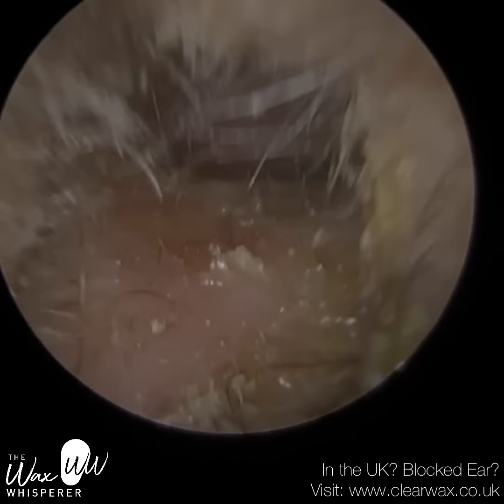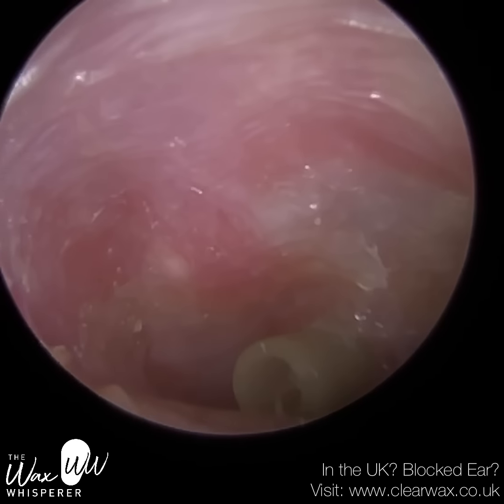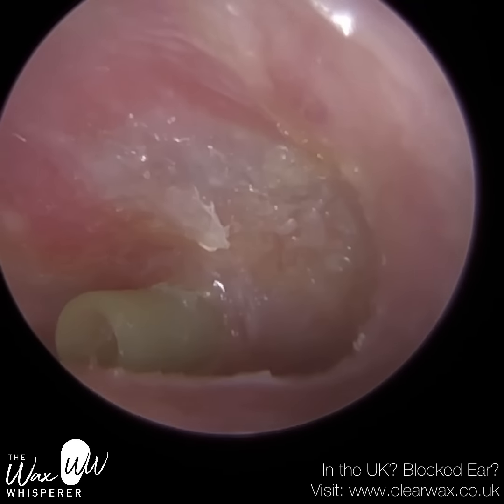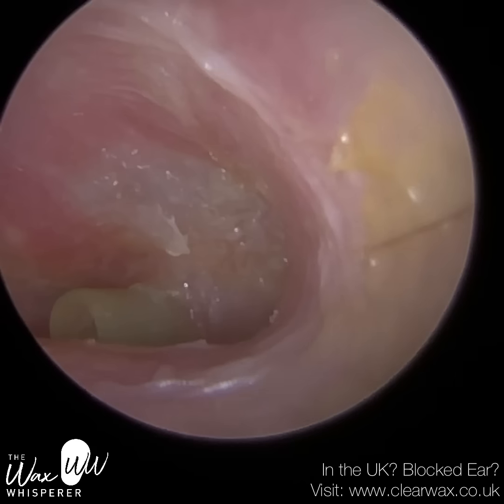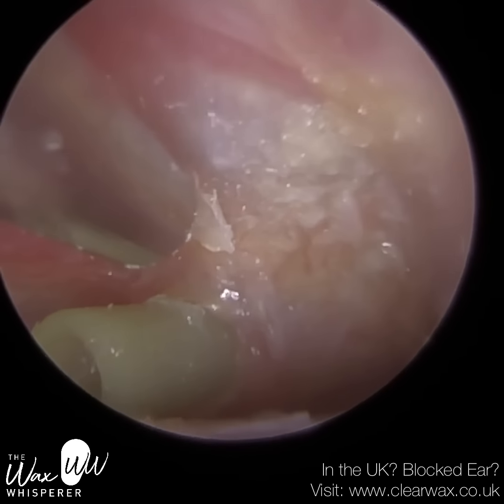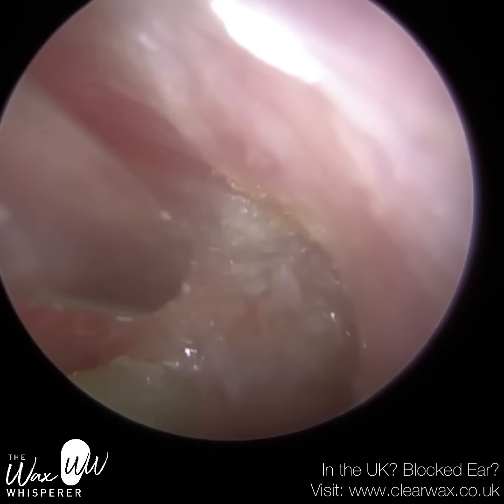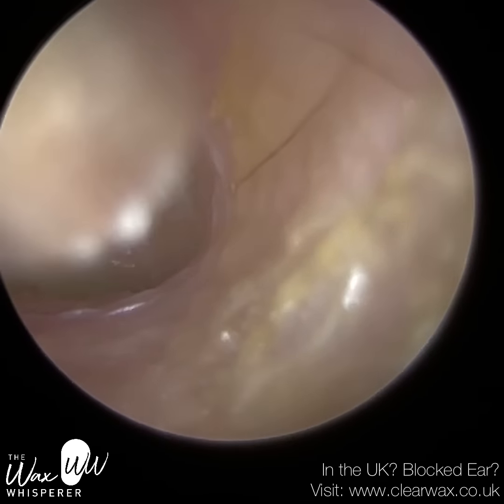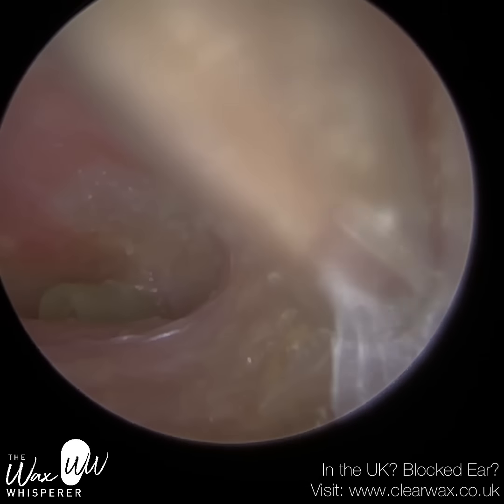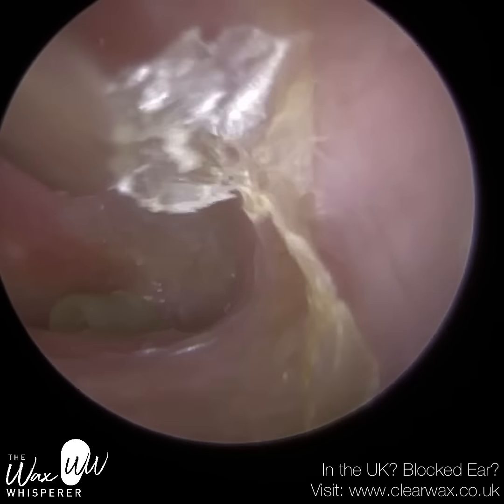And to prevent the eardrum from healing, and thus then causing the same issue to occur again for the patient, they put a grommet in, and a grommet keeps the eardrum open. It prevents it from healing. And the typical grommets in the UK are called a Shah grommet, the little white grommets. And over a period of 6 to 12 months, they naturally fall out of the eardrum, hopefully into the ear canal, or sometimes they can fall into the middle ear cavity, but that's rare. And then that grommet eventually comes out the ear by itself.